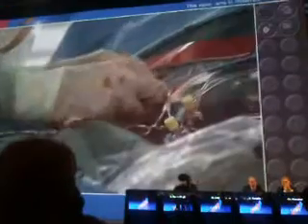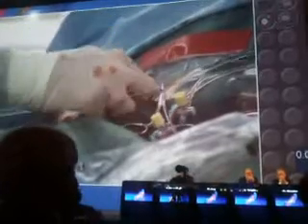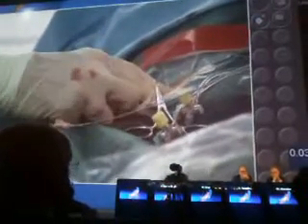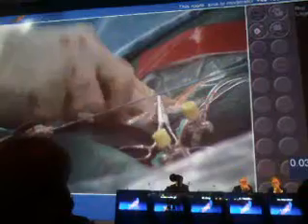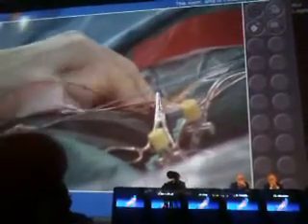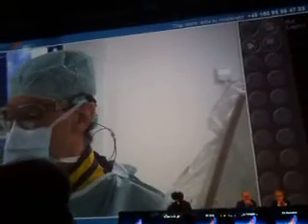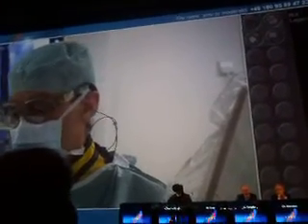It's maybe something like 10%. As is typical for younger patients, we have a relatively Gothic arch. In these cases, maybe a little more oversizing might help to have a nice seal proximally.